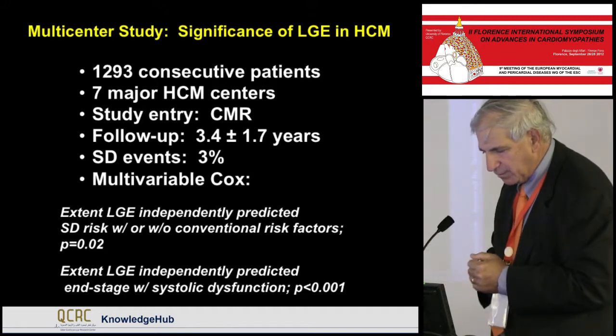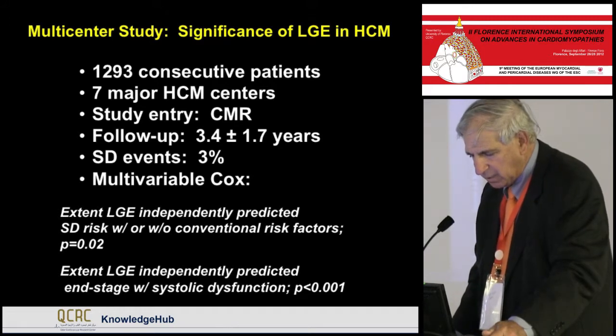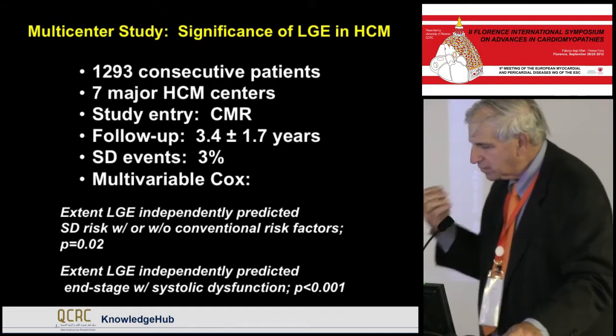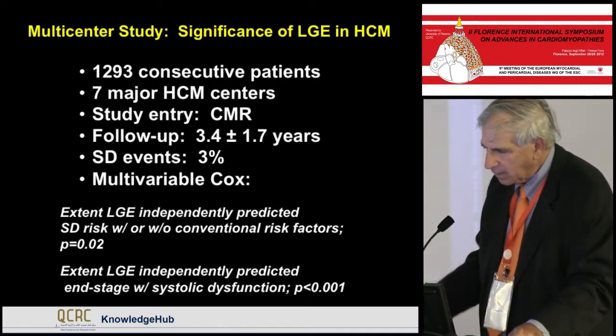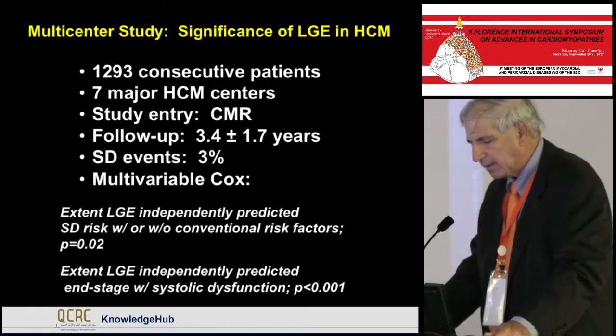All patients obviously with CMR, and then a follow-up afterward, relatively low event rate, and then the two principal findings were that the extent of LGE, as I suggested, the extent independently predicted risk for sudden cardiac death.